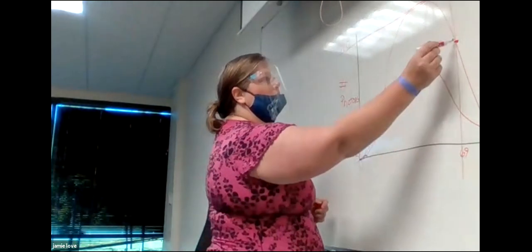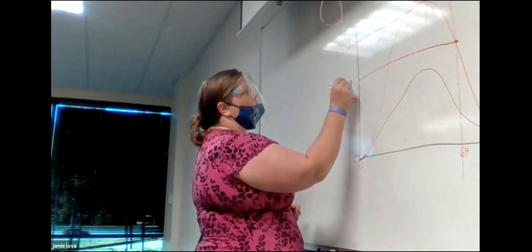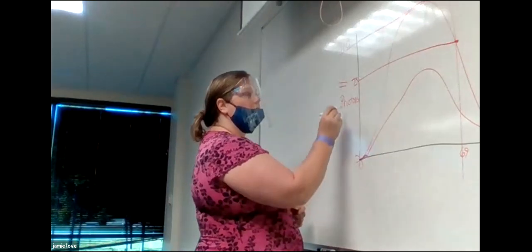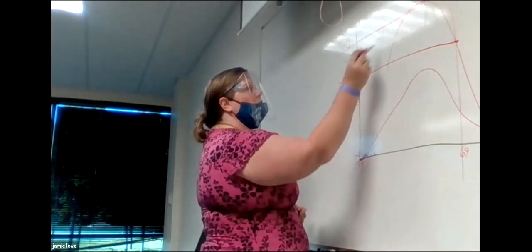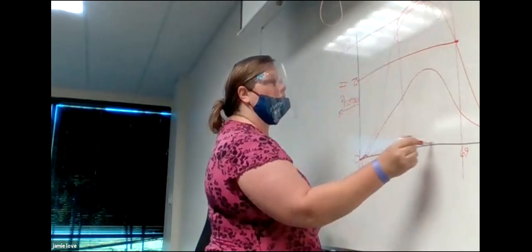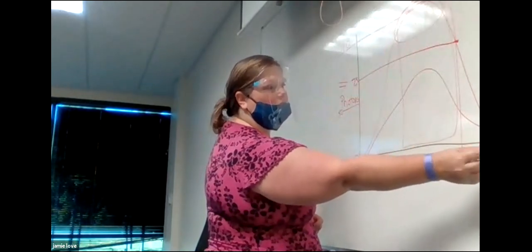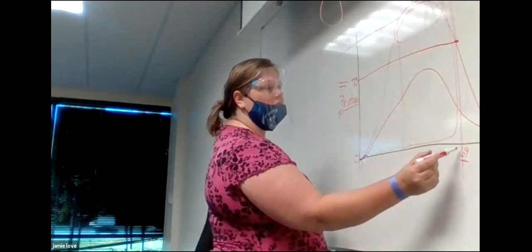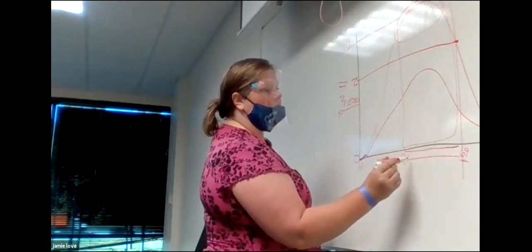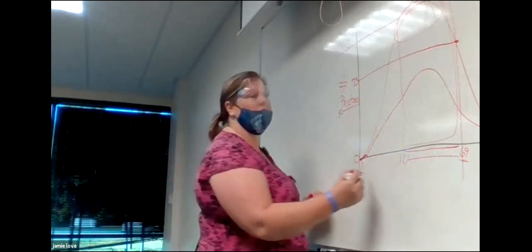But what's that? Probably 70, 75 or so. This 50 is probably here. And then at 100 photons in this range right here of energies. So if that's 69 energy, that's 100. Down here we don't have any at 100 energy. So most of our photons are here. So I would say 50 to 69. Energy level number-wise, keV, kilo electron volts energy.